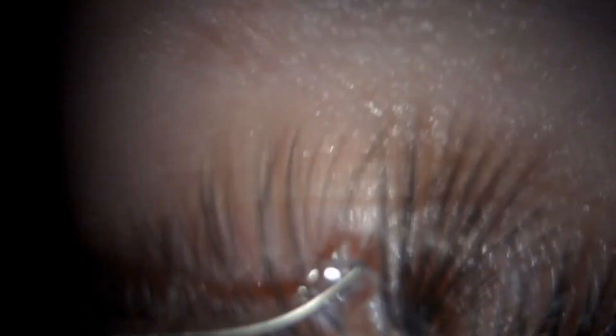Do not drag the contact lens across the cornea to avoid tearing the fresh epithelium. If the contact lens appears tight or stuck, irrigate the eye with BSS to loosen the contact lens, then try again.